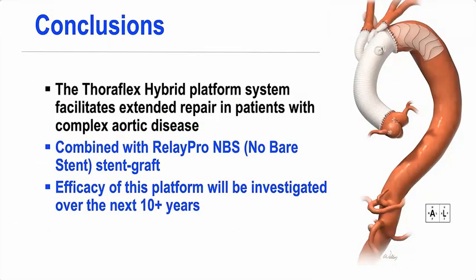So the platform facilitates extended repair for complex disease. The no bare stents are a reasonable approach, and they're going to be evaluated with this Extend trial over the next 10 years. We'll have more information shortly.